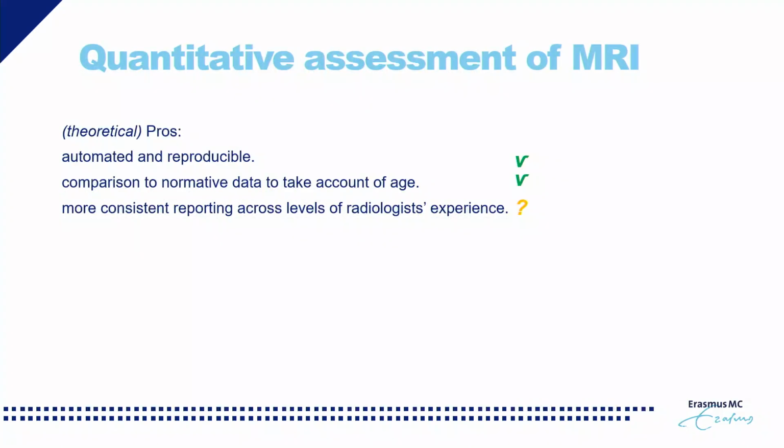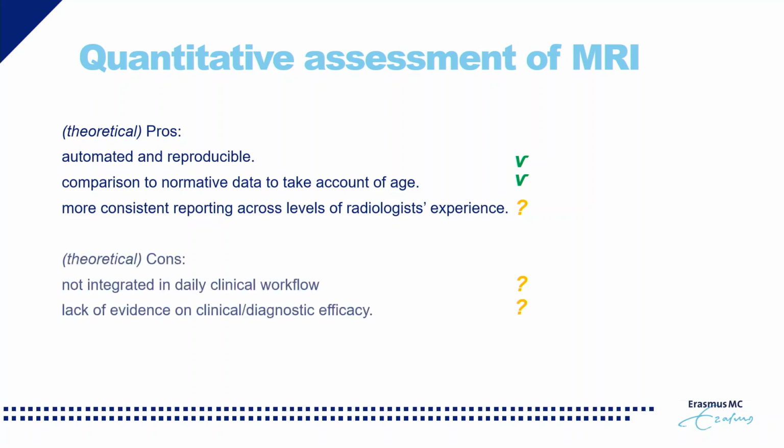So, coming back to this list of pros and cons. Technical validation seems to be done well. The software is automated and reproducible, and the normative data allow taking account of age. But we don't know yet if it indeed leads to more consistent reporting. Also on integration in the daily clinical workflow, not much is known yet. And on diagnostic clinical efficacy, we need more data to give a full answer to that question.